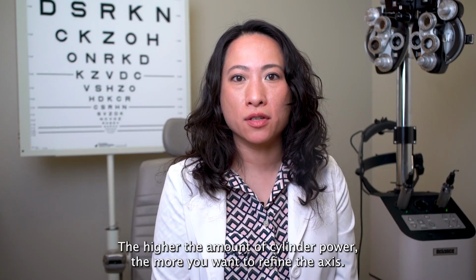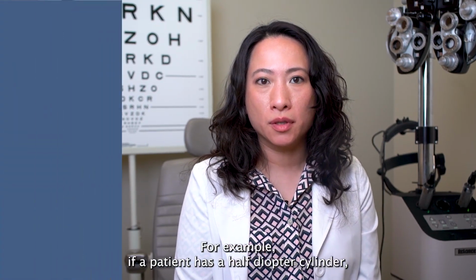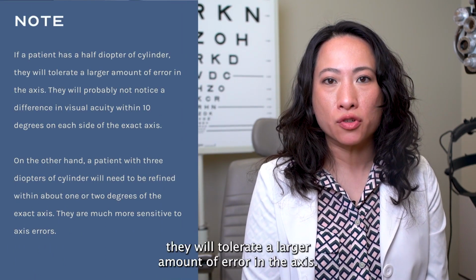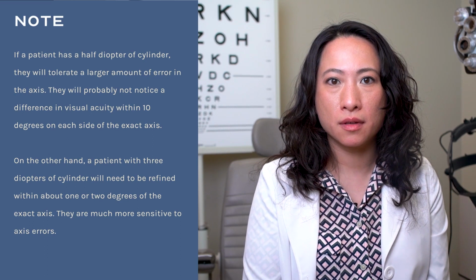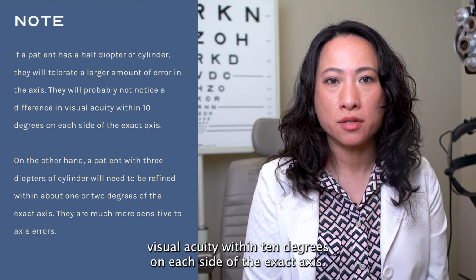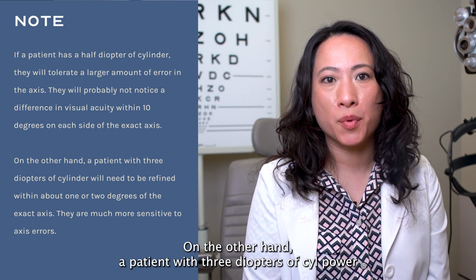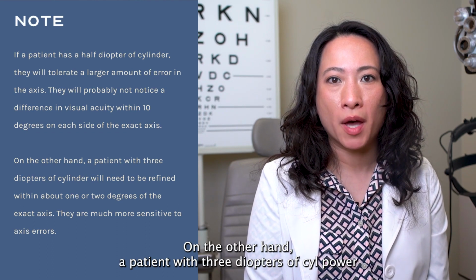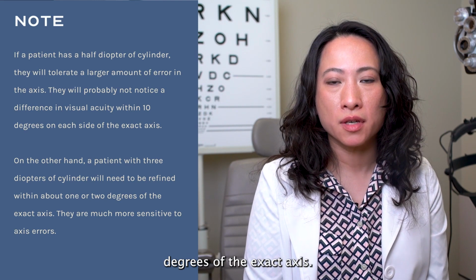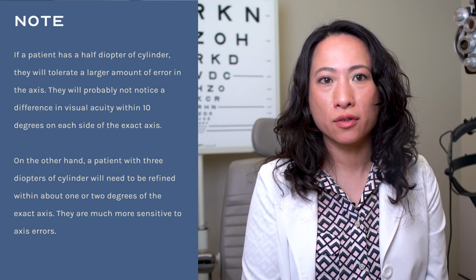The higher the amount of cylinder power, the more you want to refine the axis. For example, if a patient has a half diopter of cylinder, they will tolerate a larger amount of error in the axis. They will probably not notice a difference in visual acuity within 10 degrees on each side of the exact axis. On the other hand, a patient with 3 diopters of cylinder power will need to be refined within about 1 or 2 degrees of the exact axis. They are much more sensitive to axis error.